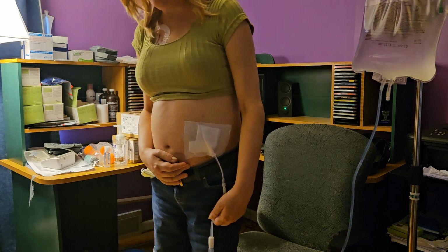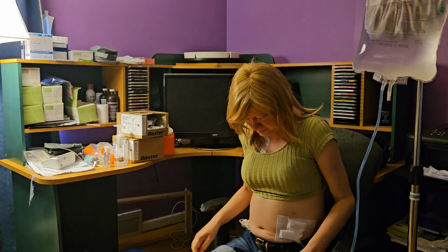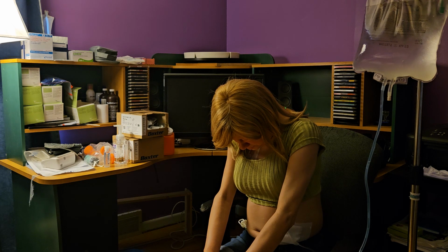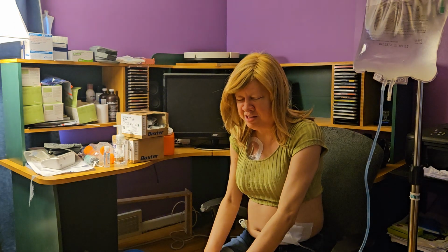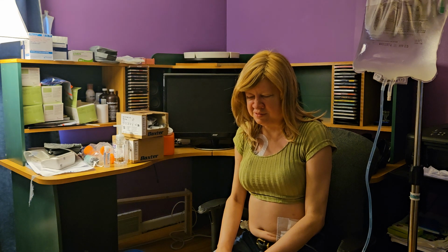Kind of hurts now. They say the pain is from the negative pressure of the fluid coming out, and it's kind of like a suction that's sucking up against your organs or your stomach. Kind of feel like period cramps. Moving around helps sometimes.